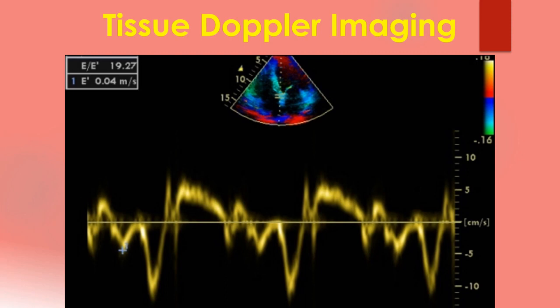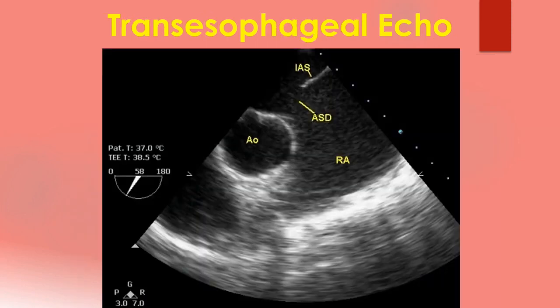Tracing in the lower part is tissue Doppler imaging from the medial mitral annulus. The images shown so far were from transthoracic echocardiography. Another mode is transesophageal echocardiography, in which the echo probe at the tip of an endoscope-like device is introduced into the esophagus. As the esophagus is just posterior to the heart, image quality is excellent.